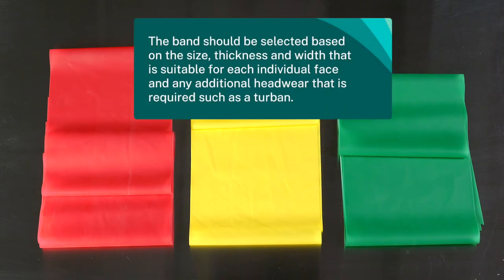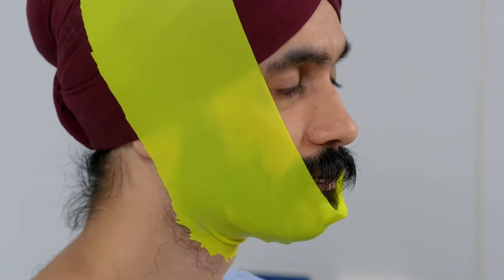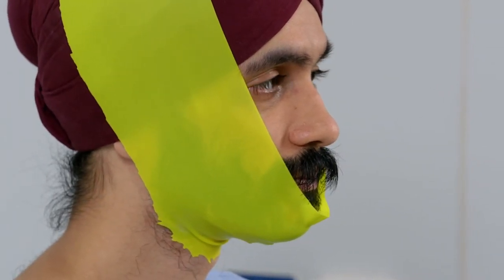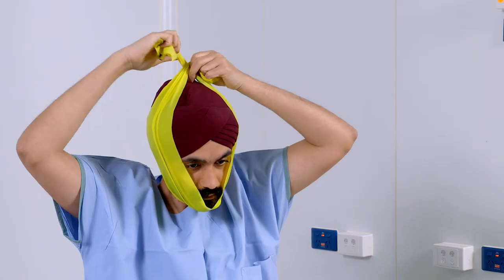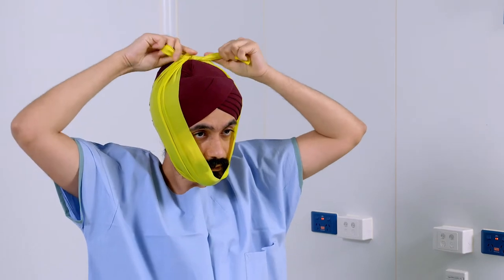The band should be selected based on the size, thickness and width that's suitable for each individual face and any additional headwear required, such as a turban. A suitable width should cover the beard hair to the neck but be able to sit flat along the sides of the face or facial area where the respirator will sit to form the seal. It should also be long enough to enable a comfortable tie that will not come undone or move.